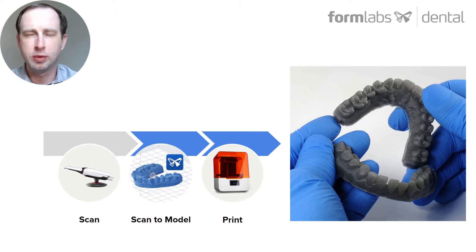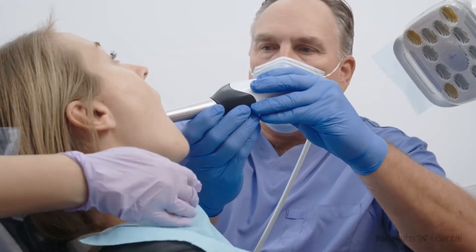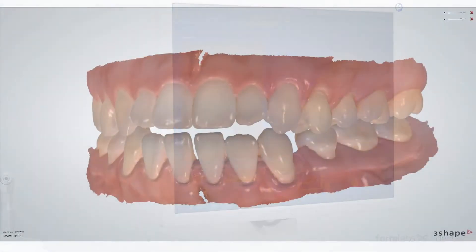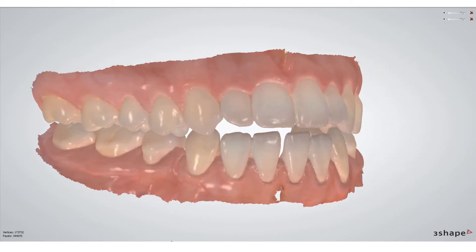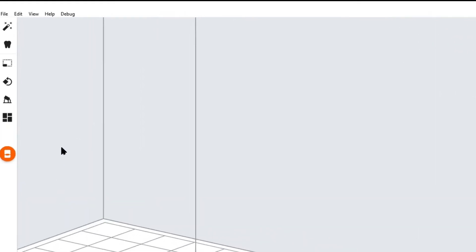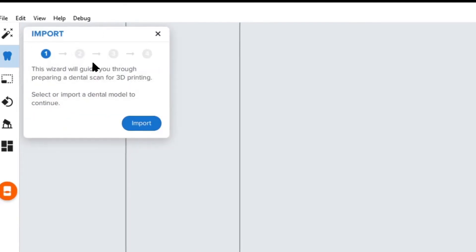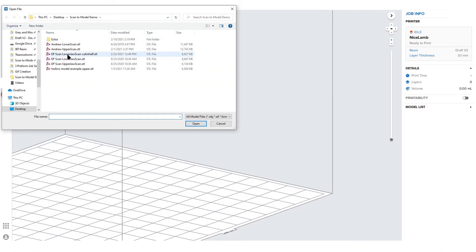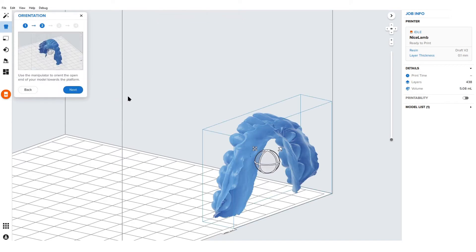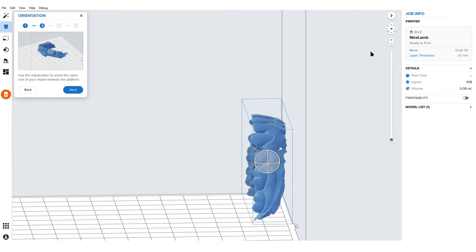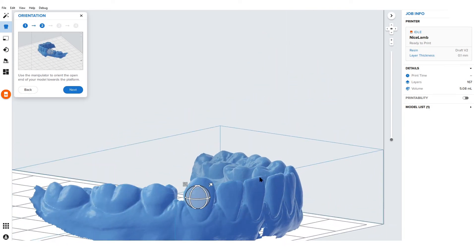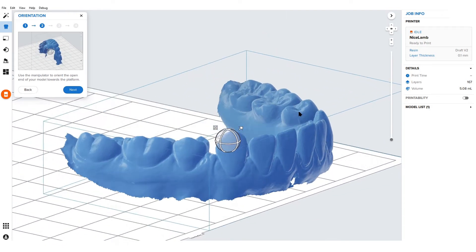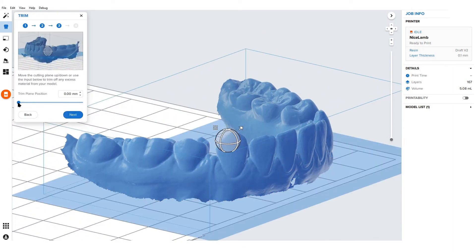To show the workflow in a little bit more detail: first you start with a 3D intraoral scan, a digital impression of the patient's anatomy or dentition. Once you have those STL files, you import those scans into PreForm Scan to Model, which is this tooth icon. You look at your file, open them, and it allows you to rotate the anatomy into place with the occlusal side facing away from the build platform.